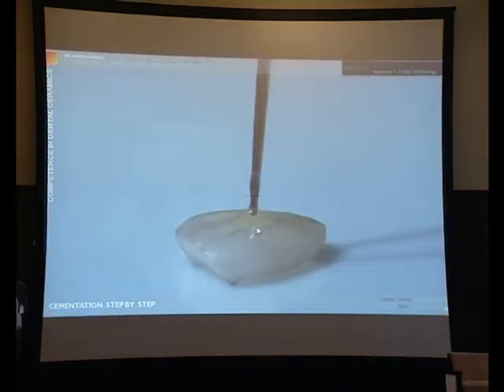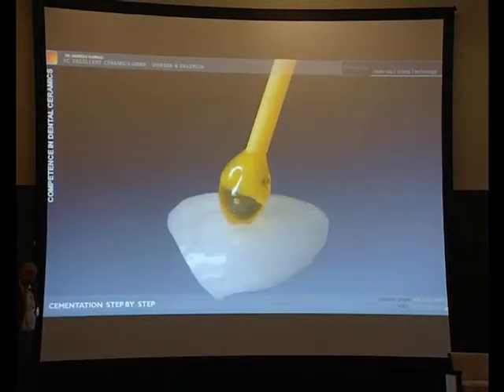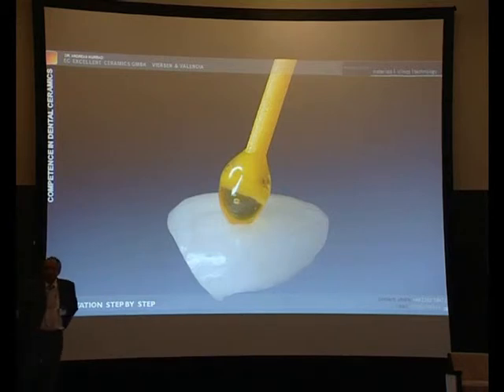How can I fix such a small veneer during this? This is a dental probe, and this is a little bit of bonding light cured. The risk that this falls down is 50%. This is delivered by Ivoclar Vivadent, then the risk of falling down is higher than 90%.